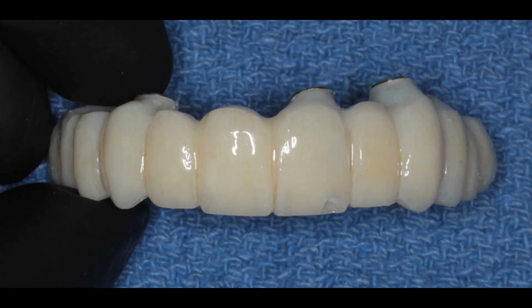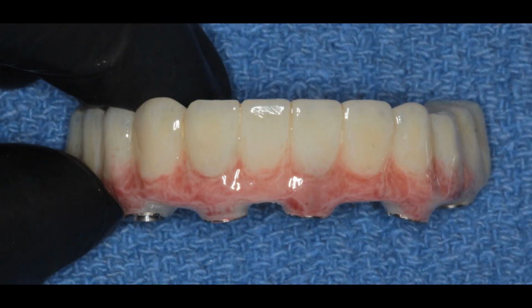First surgery, we took all the teeth out, put all the implants in, and he gets this beautiful fixed temporary with all the proper contours. Lower the same. He had lost more bone in the lower, and occasionally we do have to take some bone away in the lower, but here's his lower temporary.